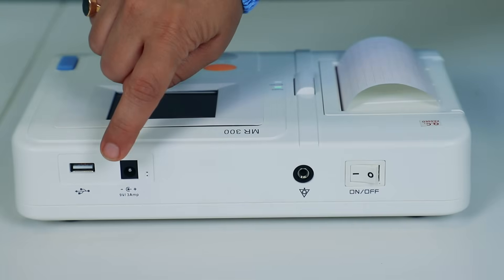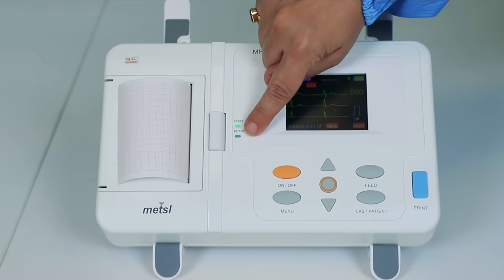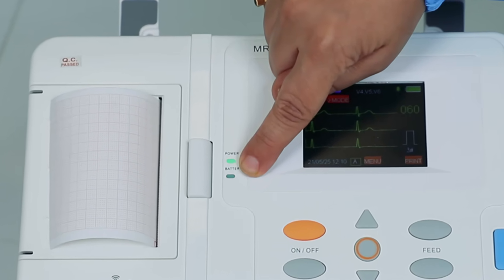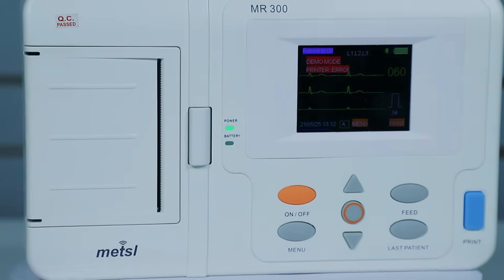And finally, to keep your device powered for extended use, simply connect the provided power adapter. The battery indicator on the screen will show its charging status, ensuring you're always ready for your next patient.